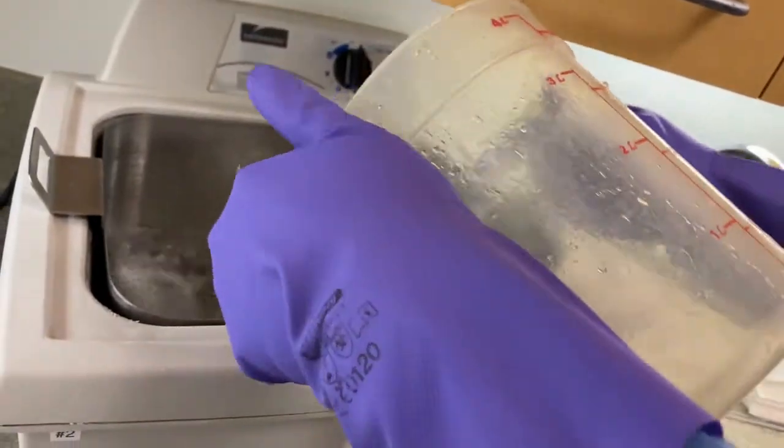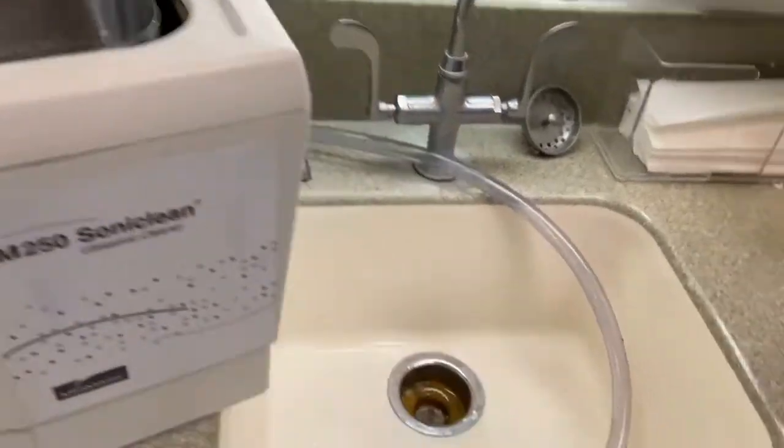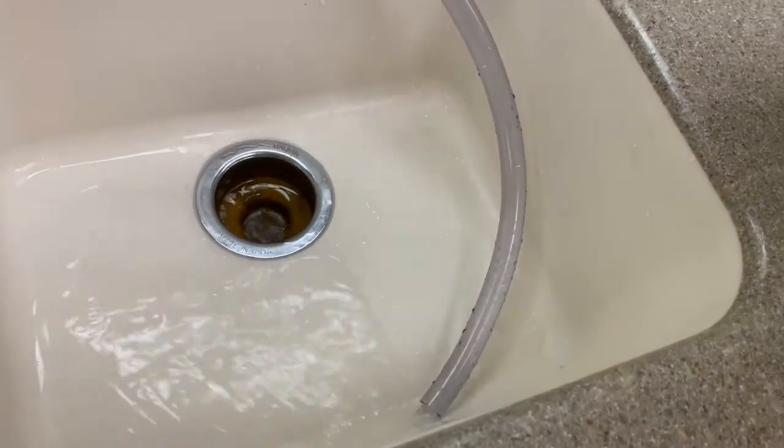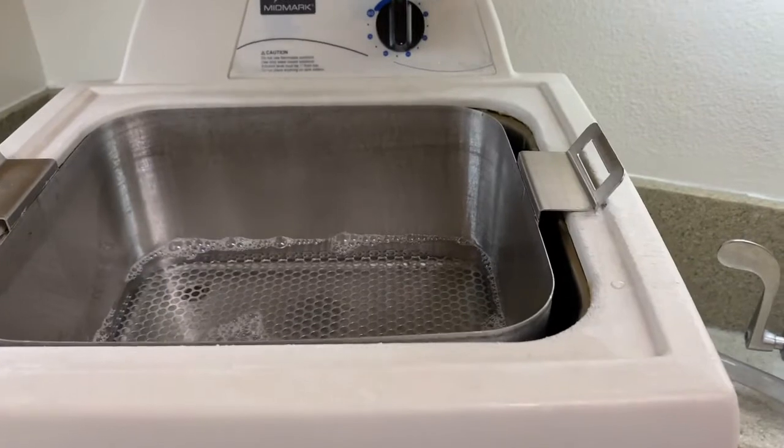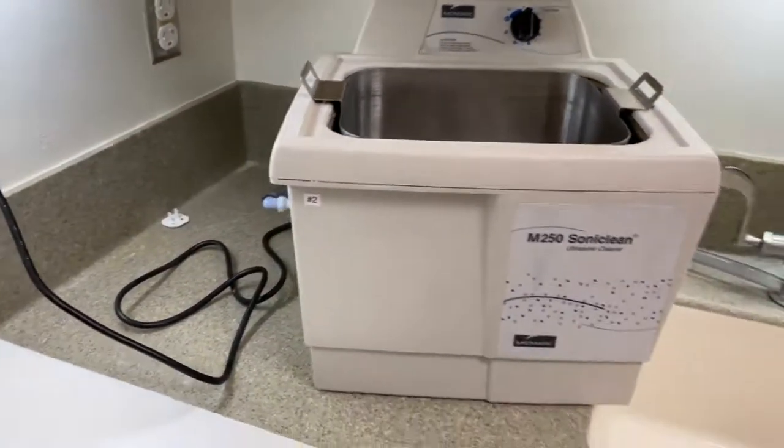Once it is fully empty, fill up water and drain it in the unit for further rinsing. Grab disinfecting wipes and wipe the whole unit, making sure all components are clean and ready to be used the next day.